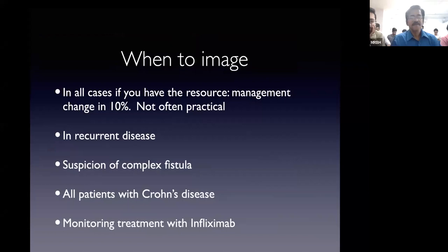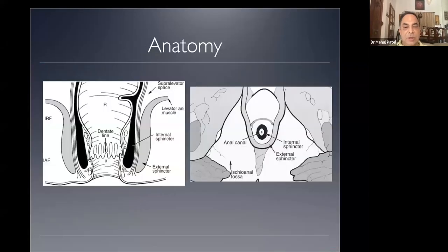Okay. Yes, sorry. Can you hear me now, right? Yes. Okay. So these are the indications of currently imaging. So the clock face.